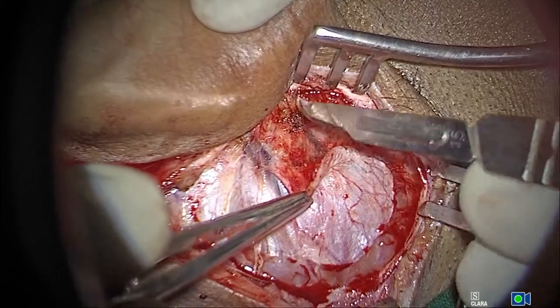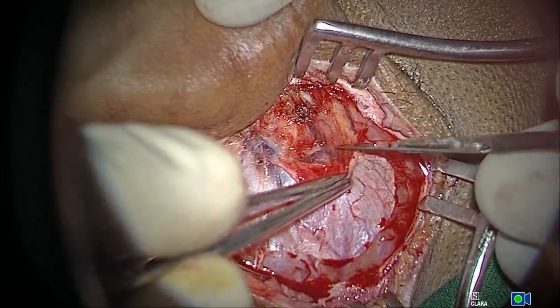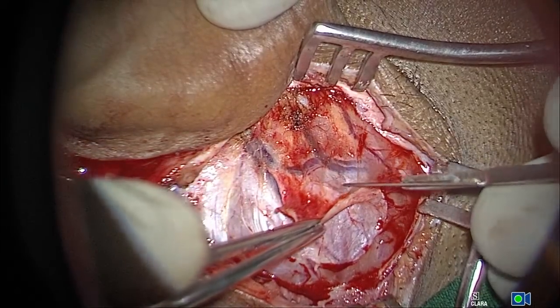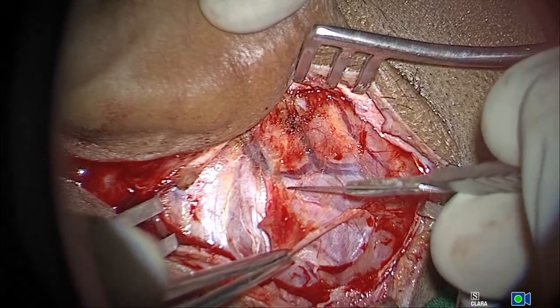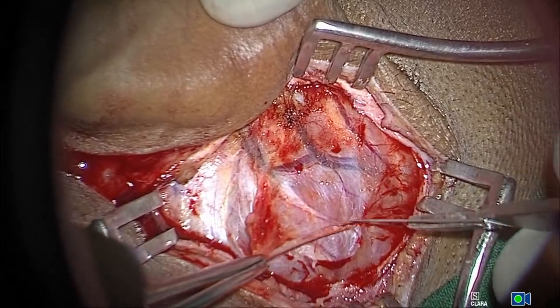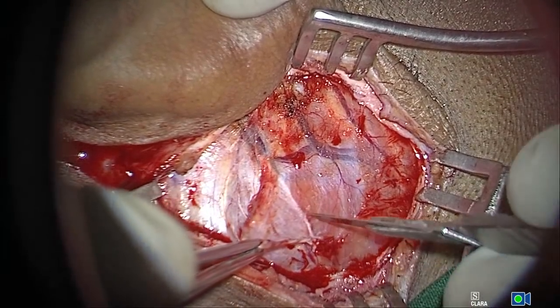There are some veins underneath. It's better we don't injure them because they will bleed. Looks lousy actually when you see that the veins bleed underneath the graft. So try to be as gentle as possible.